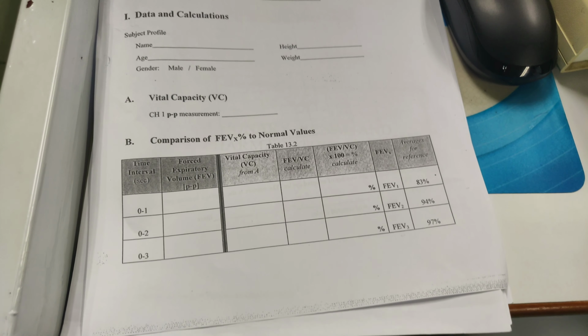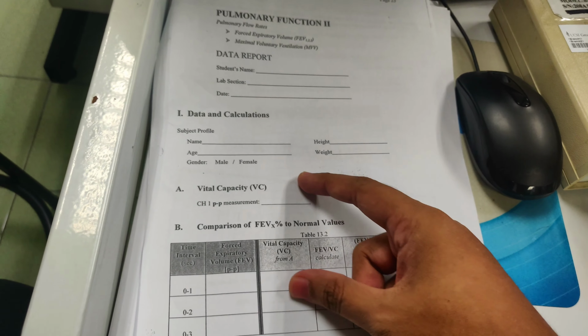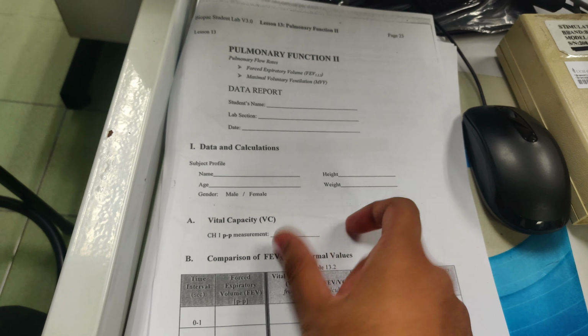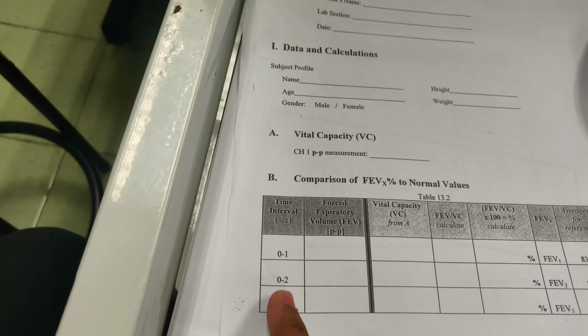So for this table, as you can see at page number 23, this is the data calculation for your report. Here we have 2 different areas. The first one is for the vital capacity. From here you can calculate each individual FEV based on each different time that you have here, which is 0 to 1 second, 0 to 2 seconds, and also 0 to 3 seconds.